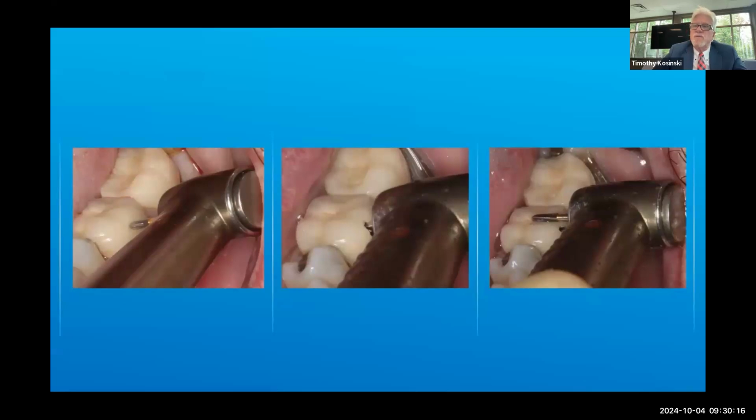Now, most of us remove a crown. I'm assuming you'll take some type of burr and section on the facial, onto the occlusal, onto the lingual here, take some type of instrument and elevate. The mesial section usually comes off, and then you have to get the distal section off. Here I'm using what's referred to as a WAM key.